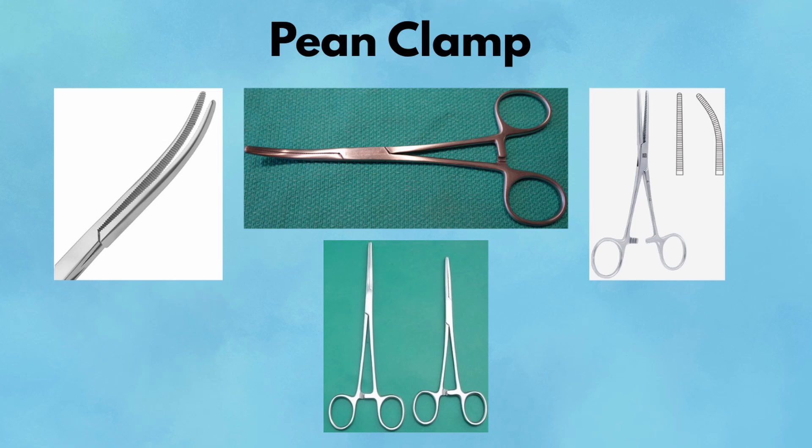Pearl: great for deep, blind placements — its length allows for control in spaces where your fingers can't reach. Pitfall: the crushing force is significant. Never use peen clamps on ureters, nerves, or friable structures. You'll damage what you're trying to preserve.